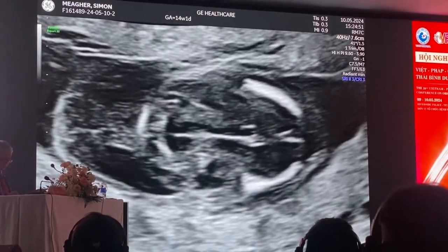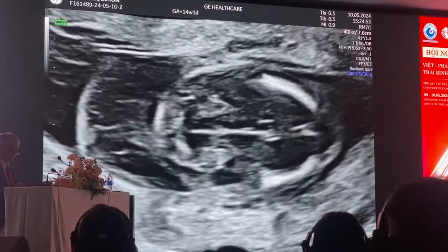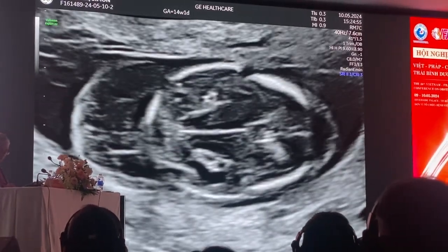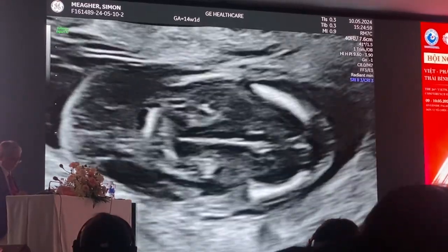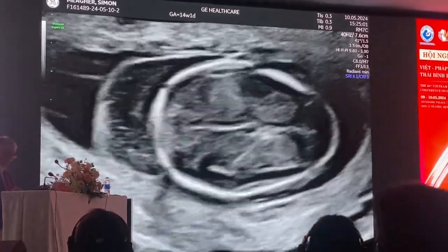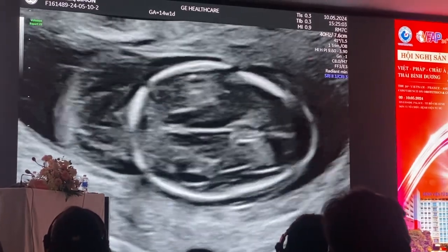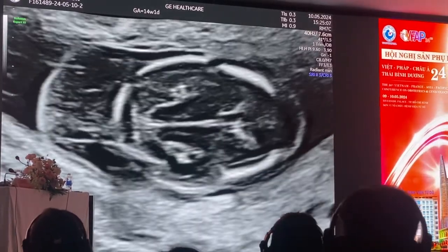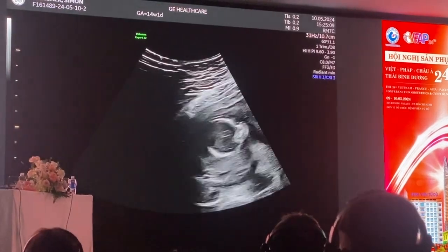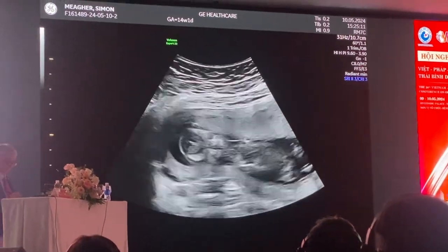When you've got in that position, sometimes a good exercise is just to increase your dynamic range and then just tap the abdomen. And sometimes you will appreciate, particularly for the patient to understand, if you say you see through behind, and you just tap the baby, the patient will sometimes understand it much more than just taking a static measurement.